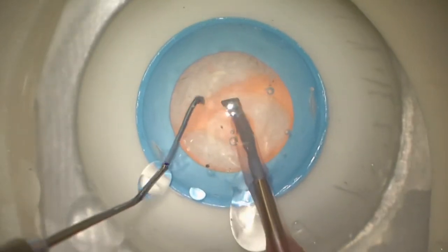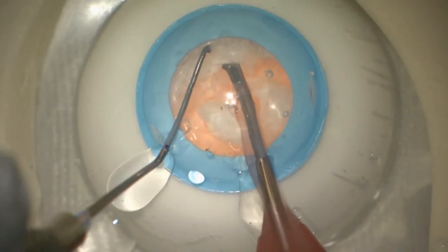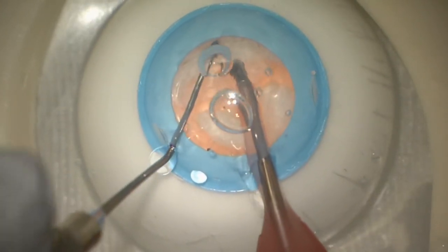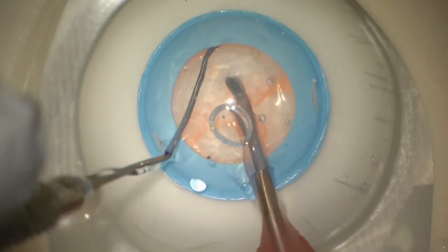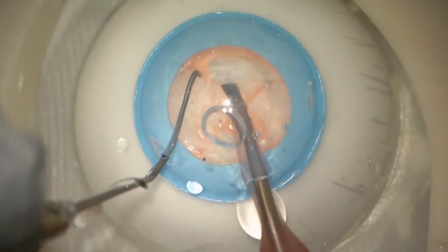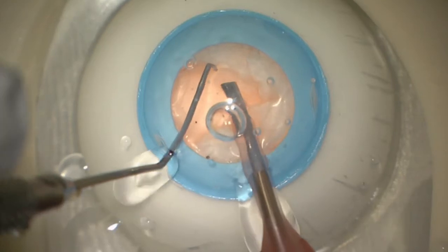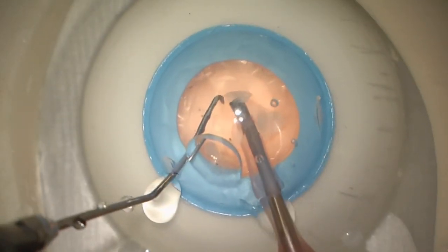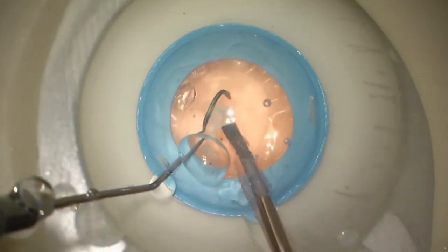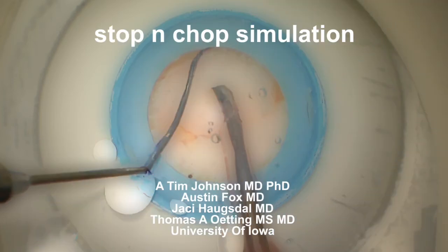But these PS12 eyes from Phillips are just great for simulating nuclear practice. You can do this in your operating room with your microscope and your instruments. There are no animal products or cadaver products, so you don't have to worry about using these in a real OR. The fluidics is also a great topic to discuss when doing this teaching. This is Tom from the University of Iowa — thank you very much.